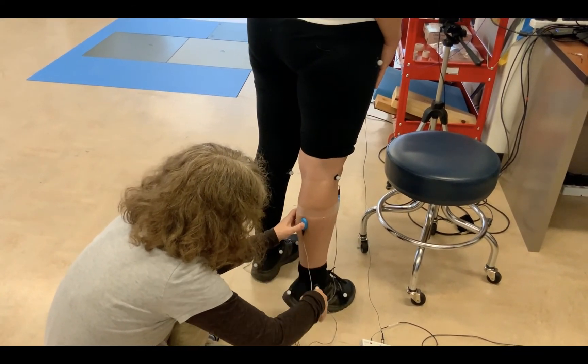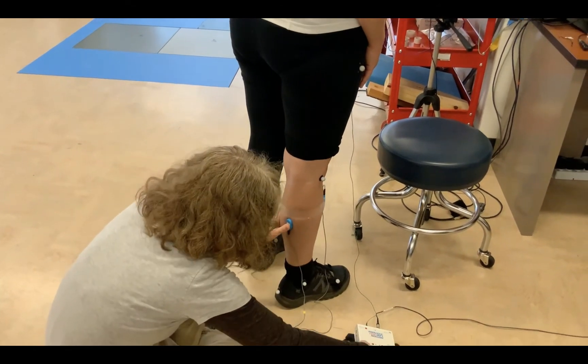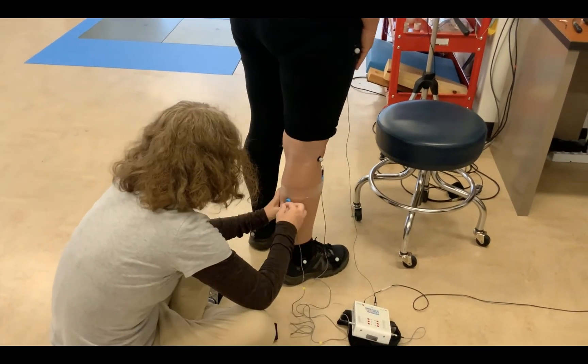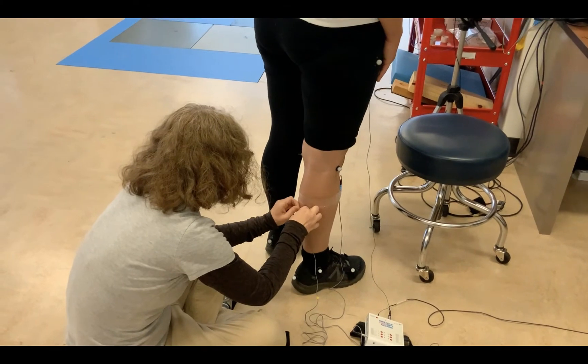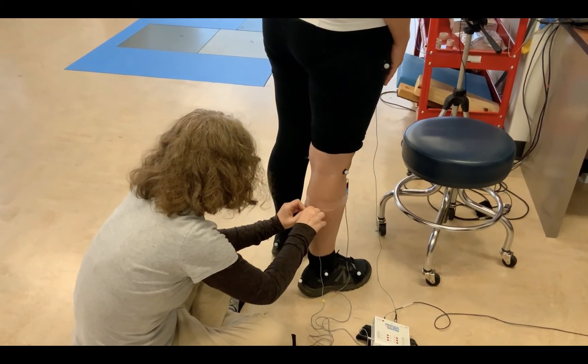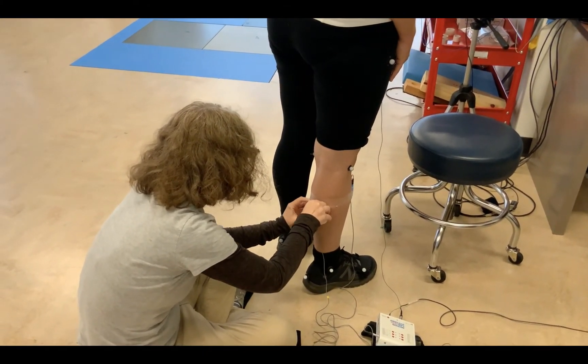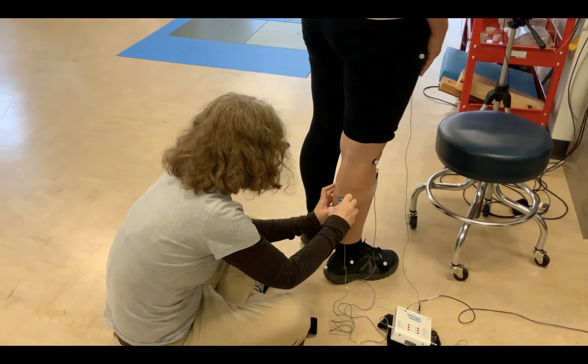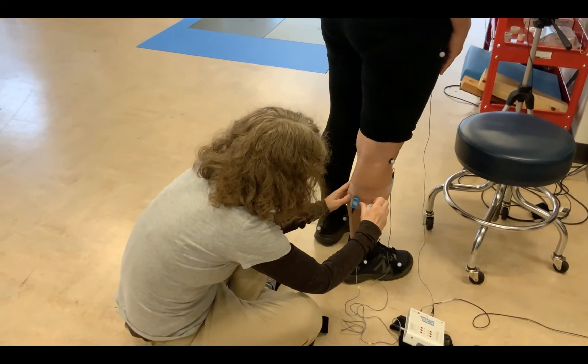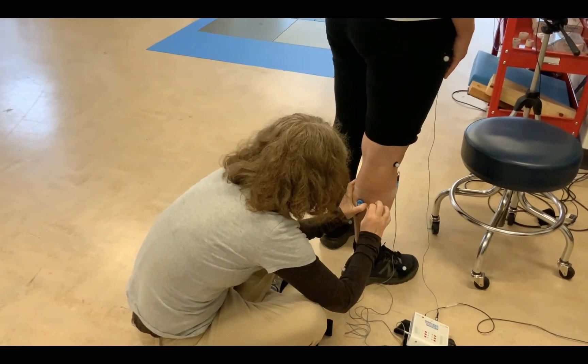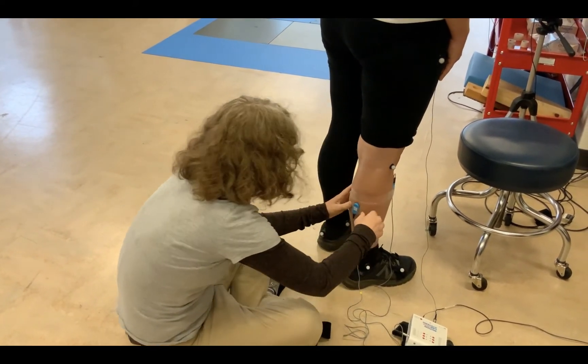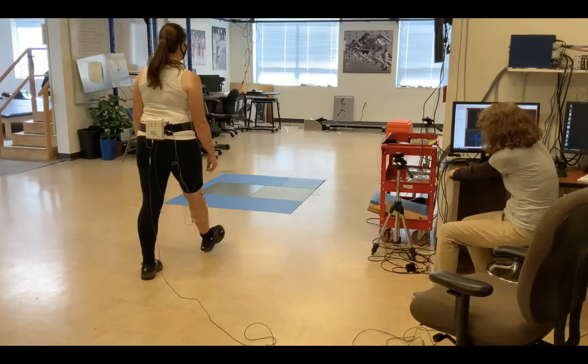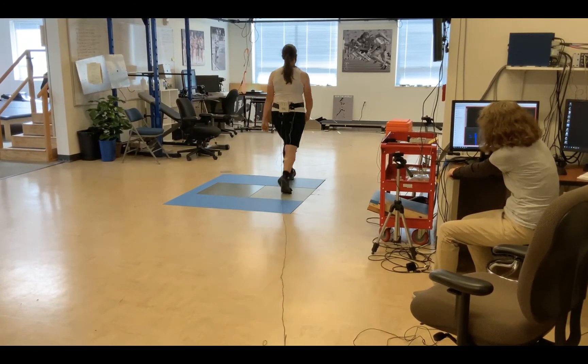And we'll tape it in place in preparation for the subject doing a walking trial. So the muscle sensor is taped in place snugly so it's not going anywhere, and then the subject puts the pack on and does some walking, dragging the cord behind her.